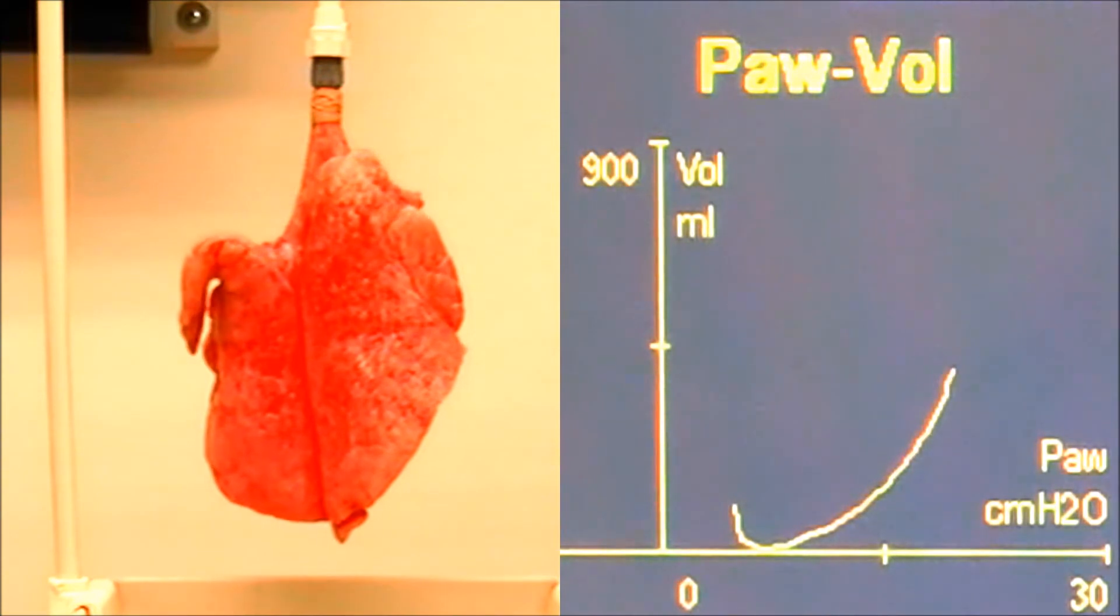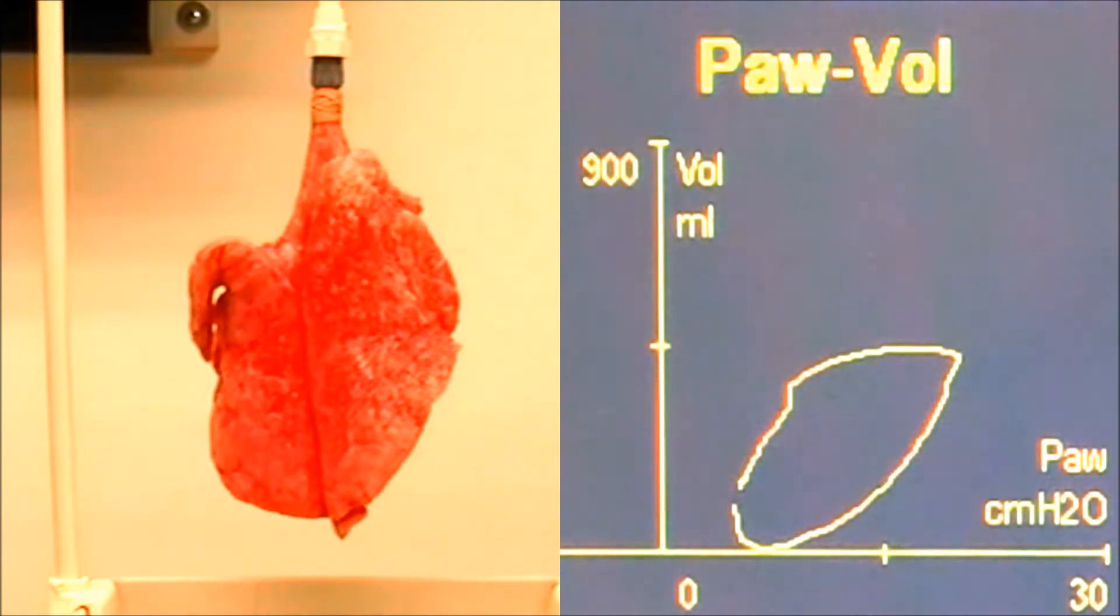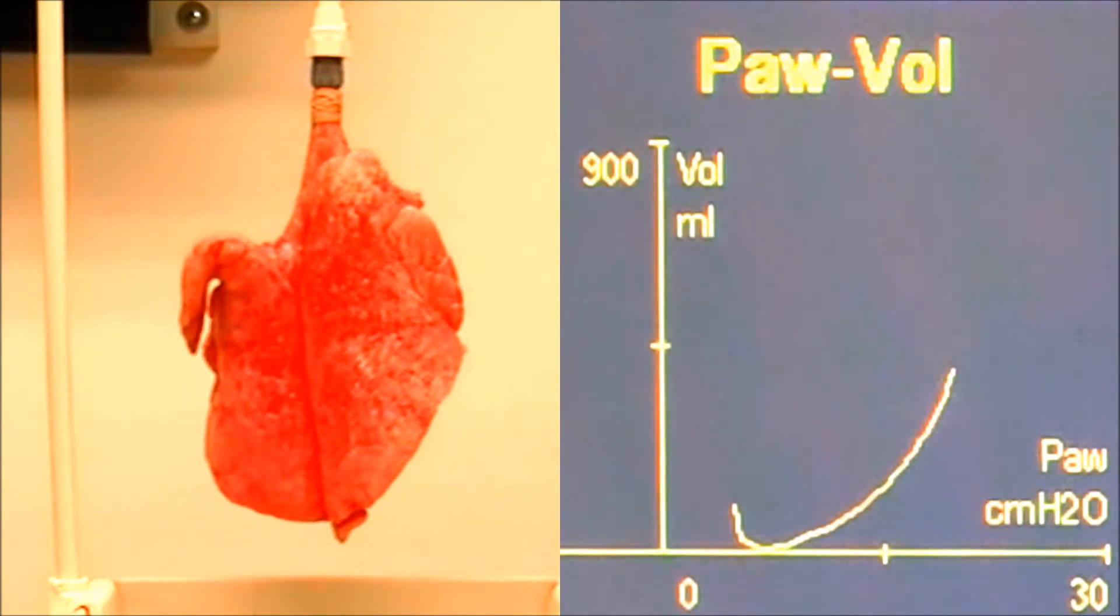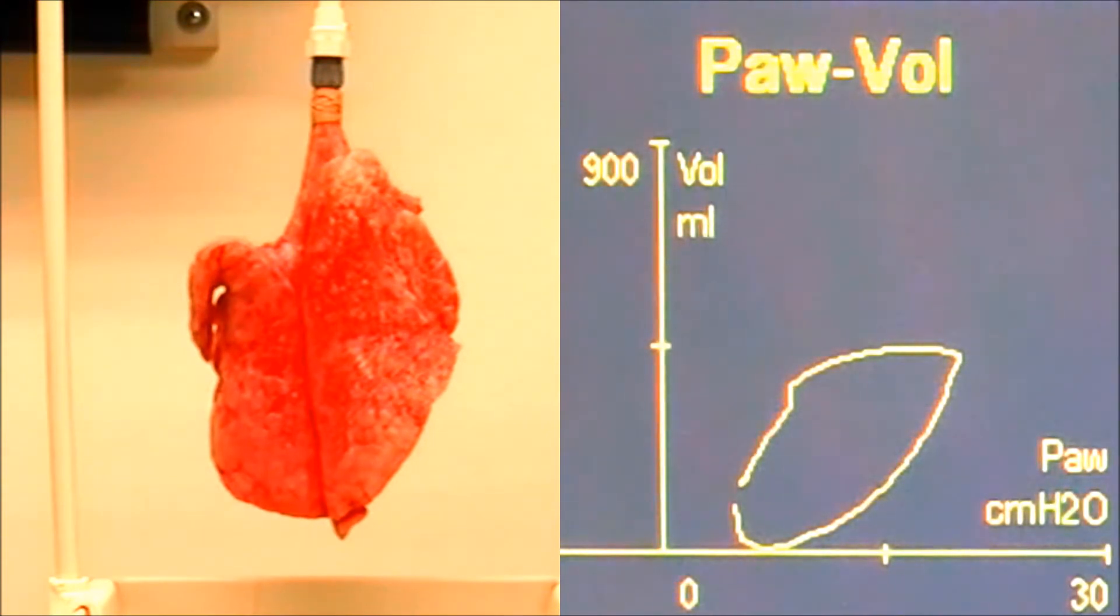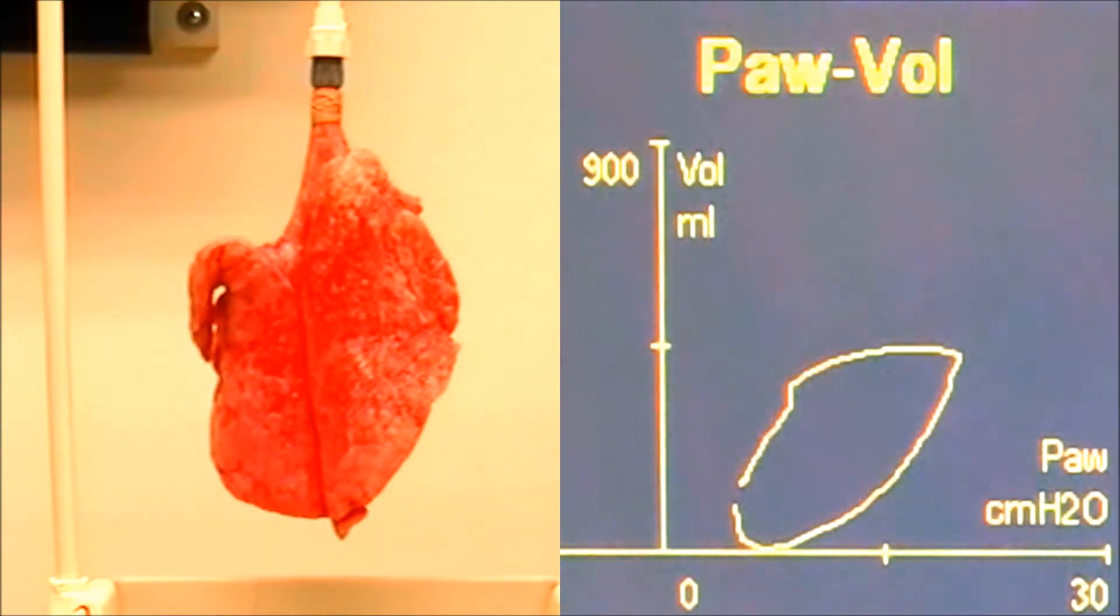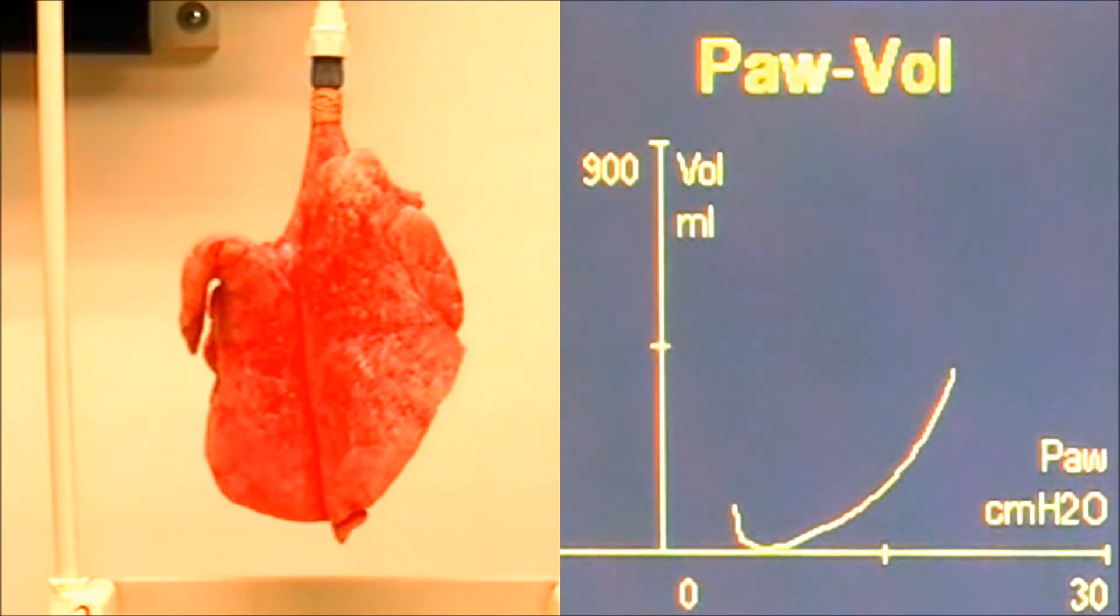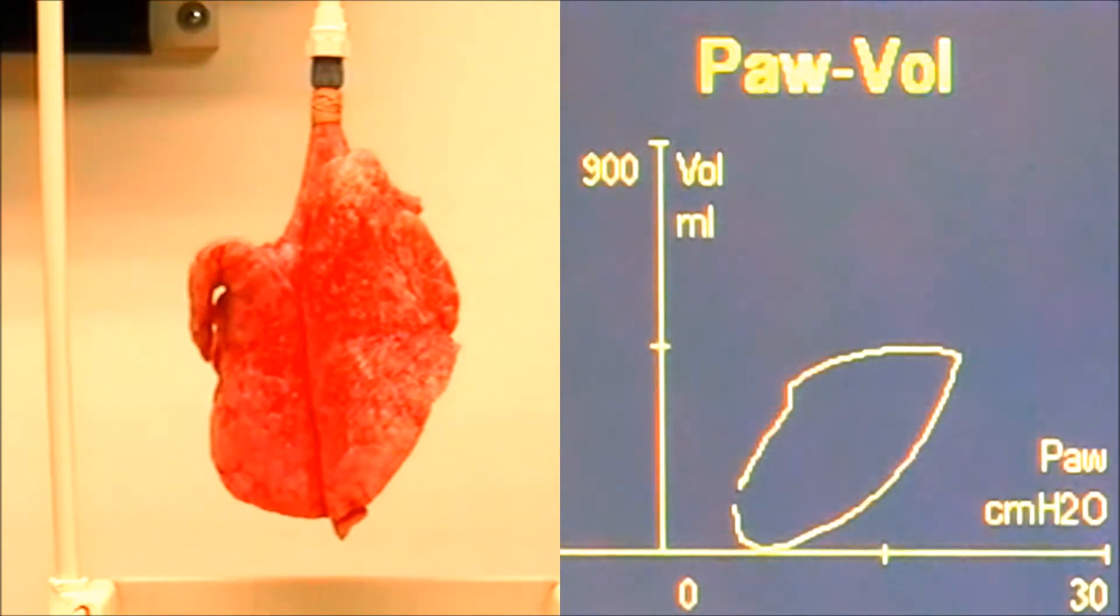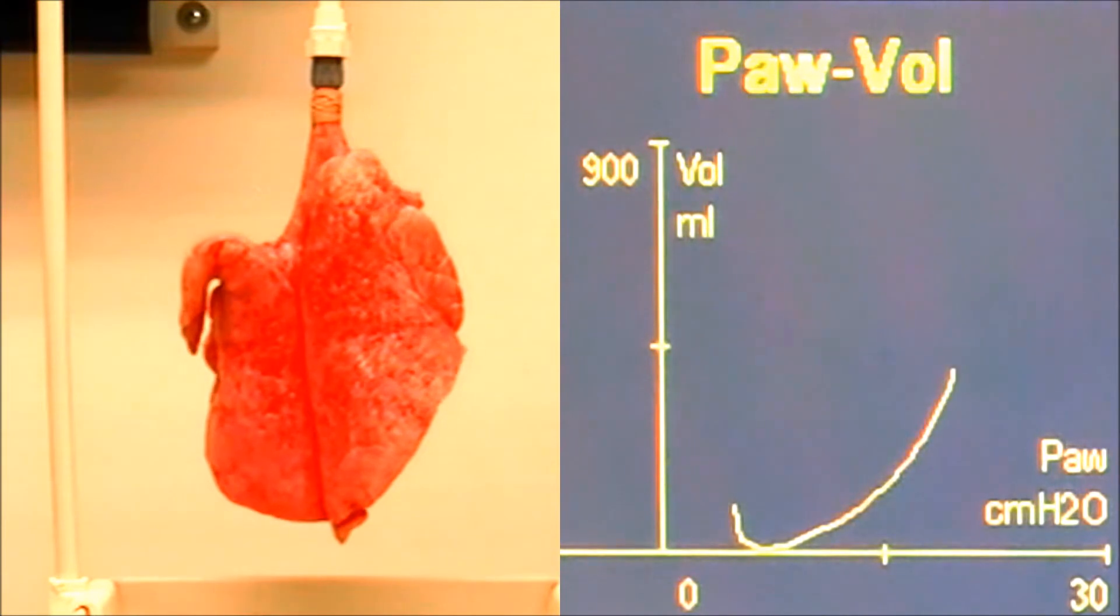We're going to show you how to do a sustained recruitment breath. The thing I want to point out is we're on five of PEEP right now. If I recruit and go back to five of PEEP, my recruitment breath didn't really do anything because I'm going to need more PEEP than I have now to keep my lung open. So we'll demonstrate that.